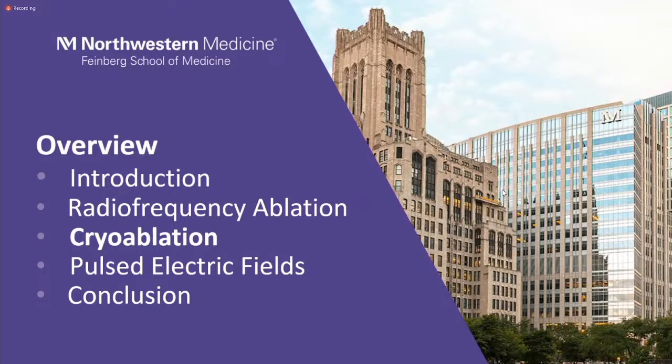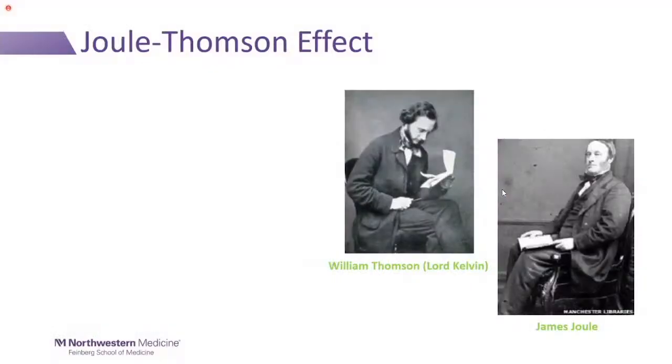All right, I have 8 minutes to go through cryoablation and pulsed electric fields. We will do it. So cryoablation, I just have 3 slides. It's all about this thing called the Joule-Thomson effect. James Joule, we know, and Thomson is actually Lord Kelvin. The concept is the change in temperature of an expanding gas.